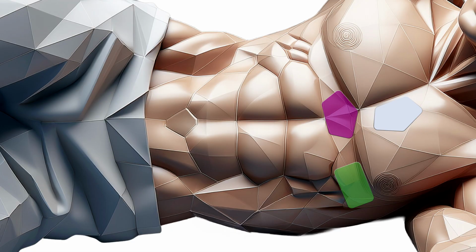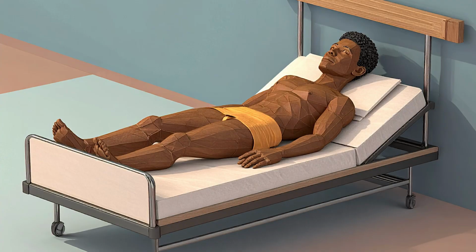Patient positioning. Ideally, patients should lie on the left lateral with the left arm extended. It is likely, however, that you may not be able to change the position of a patient due to hemodynamic instability. This will limit one or more of the following views. Ideally, you should be standing on the patient's right side if you are right side dominant.